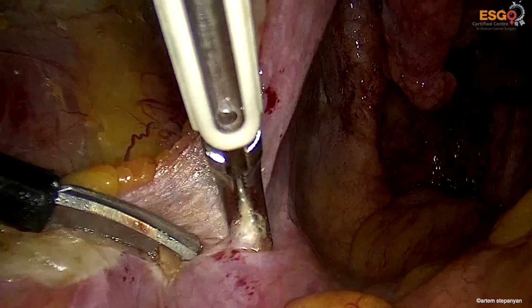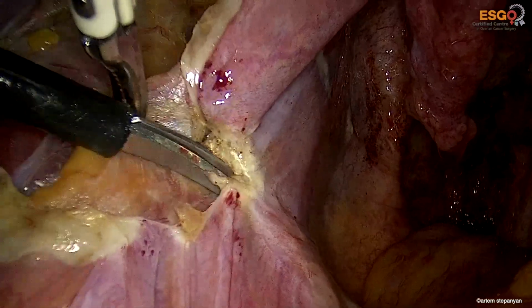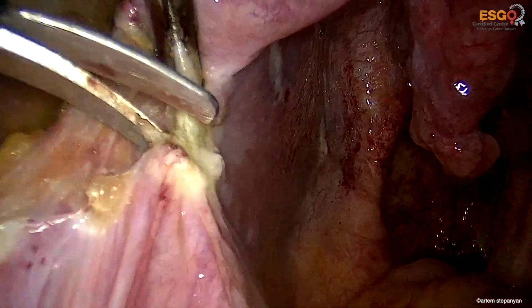We start isolation of the vessels of the IP ligament, coagulating and cutting the peritoneum over those vessels.